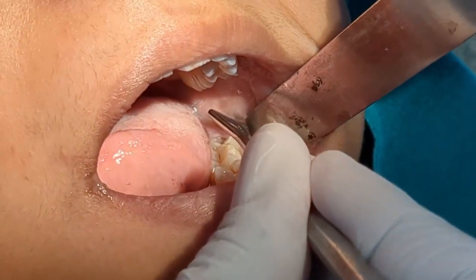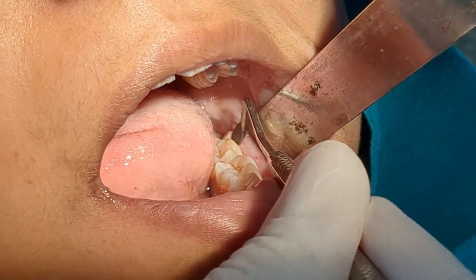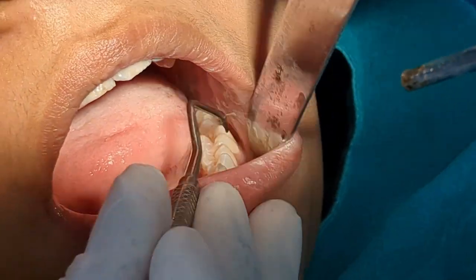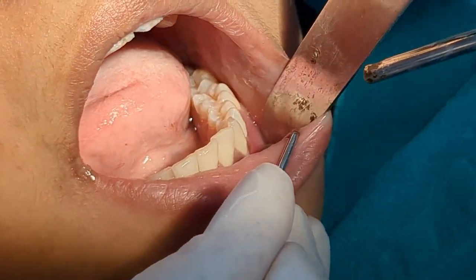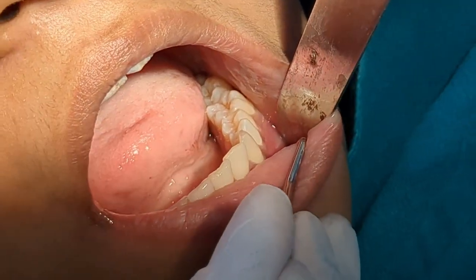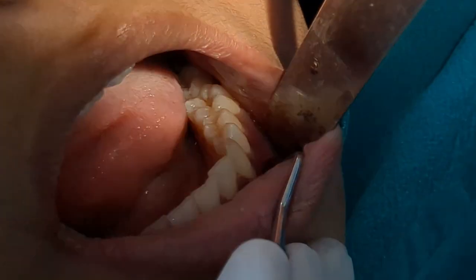Now I'm going to show you — in the premolar region I'm going to use the instrument to check for the inferior alveolar nerve block.